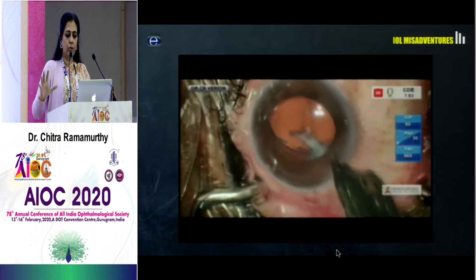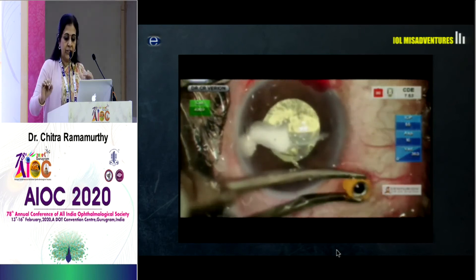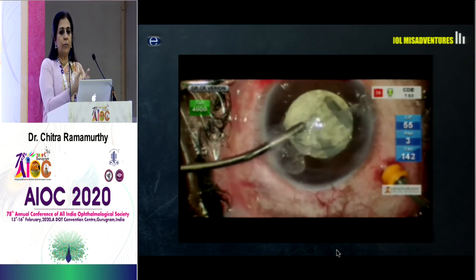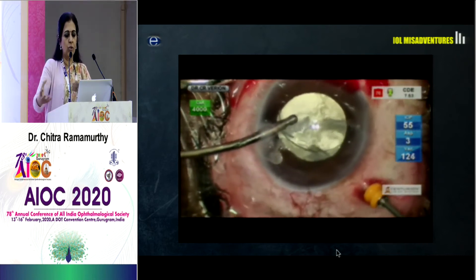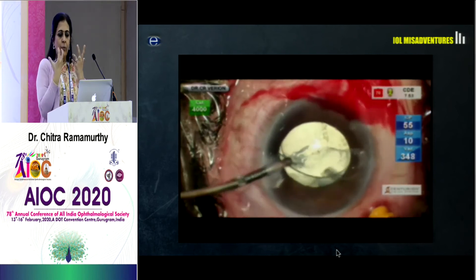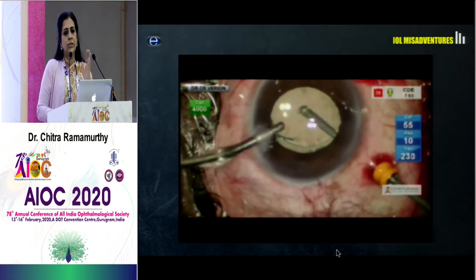The last video: a patient comes back the next day with a small endonucleus fragment behind the IOL. A PCR had occurred but the IOL had been placed in the bag. I inject triamcinolone, place a trocar in the pars plana, and do a vitrectomy from behind. By doing vitrectomy from behind, there is no gush of vitreous coming forward because you are cutting vitreous close to its home — less vitreous traction, less chance of the posterior capsule tear increasing in size. After adequate clearing, you can leave the IOL, which is well centered and seated, and get out.